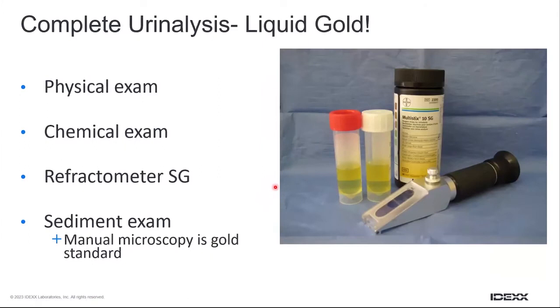With lower urinary tract disease, it is really important that we perform full urine analysis. So full urine analysis involves physical exam, the chemical exam, the specific gravity by refractometer, and also a sediment exam. So let's talk through those steps.